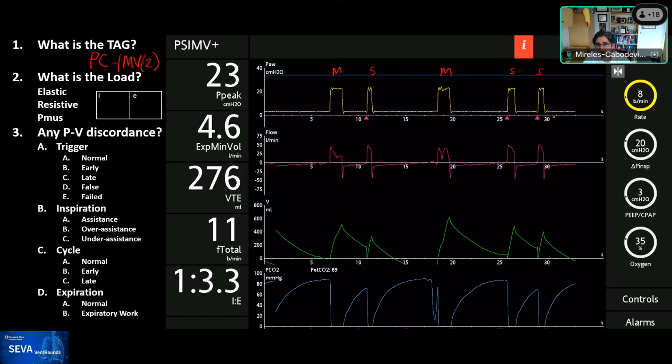And then the targeting scheme, how do you know it is 2 versus 3? Great question, Leora. The only way to figure that out is to read the manual for these ventilators. Sometimes you can do some testing, but I would ask Rob to comment. The difference between 2 and 3 is what, Rob?